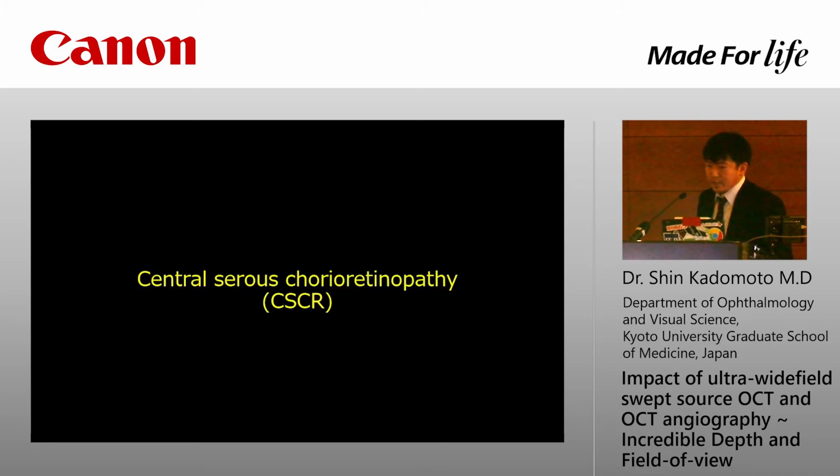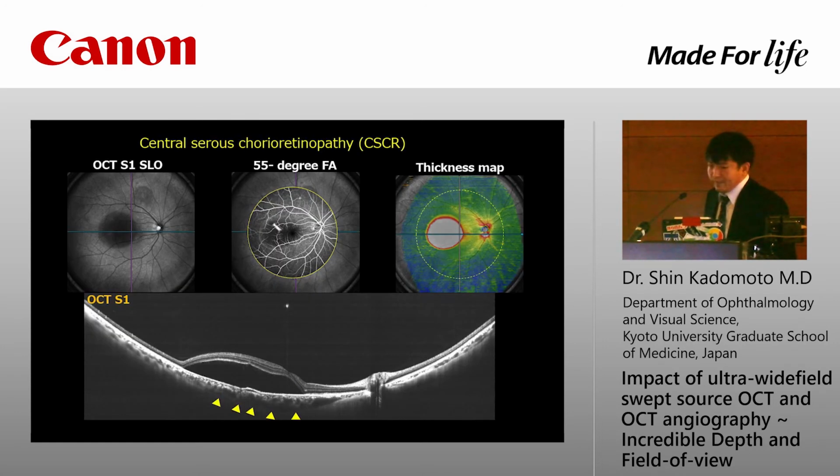Next case is CSC, which is recently categorized as a pachychoroid spectrum disease. The ultra-wide field OCT can detect the choroid and the scleral interface in CSC. The huge serous retinal detachment was completely captured.